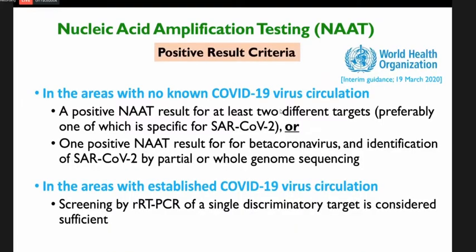This slide shows some of the criteria used to assess whether the test is positive as recommended by WHO.